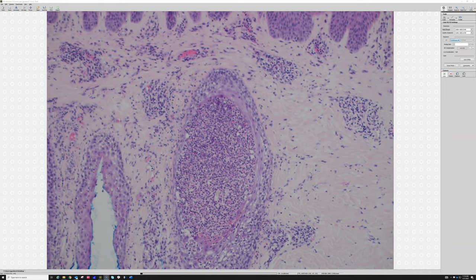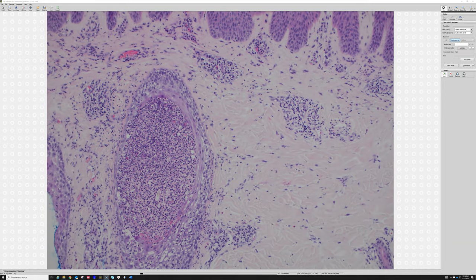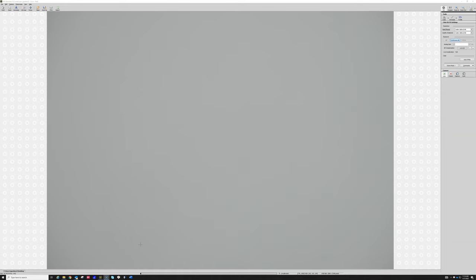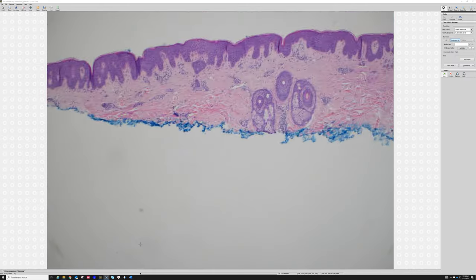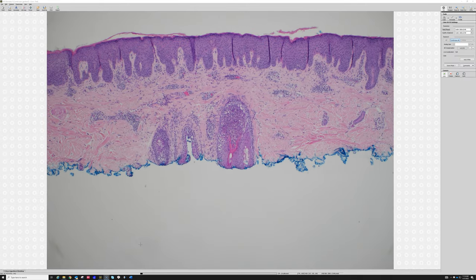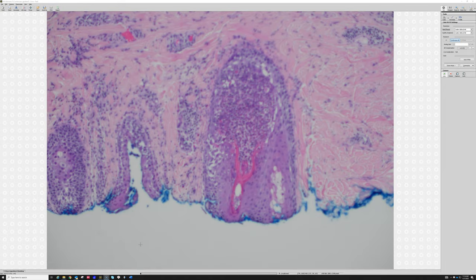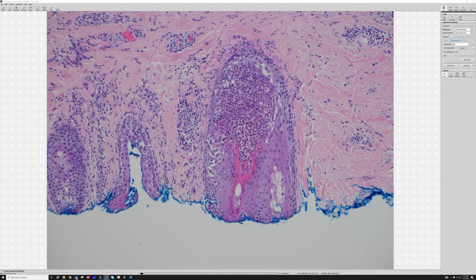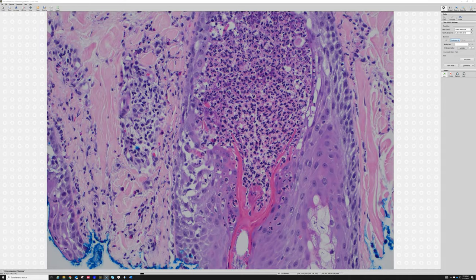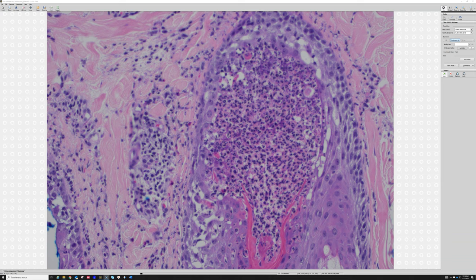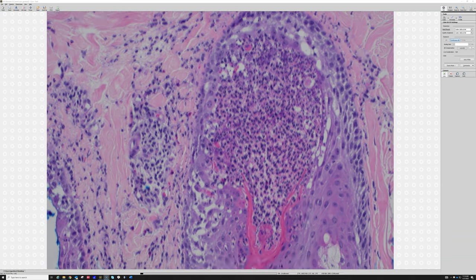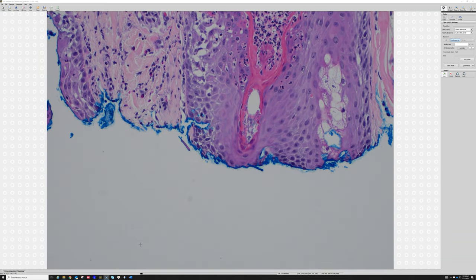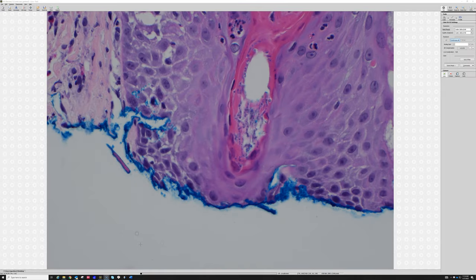I actually pulled a couple of extra slides from this case — other sections — to see if we could see it more clearly. Here's another view of that same follicle. And look at the difference: just a slightly different section, just a little bit deeper into the block, and you've got the pustule again in the follicle, and jackpot — we can actually see the fungus right there.